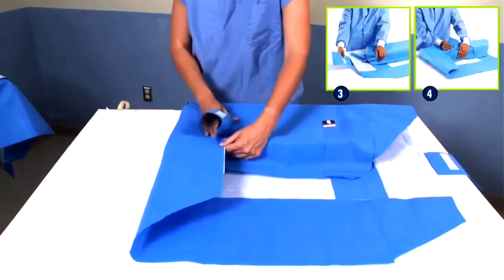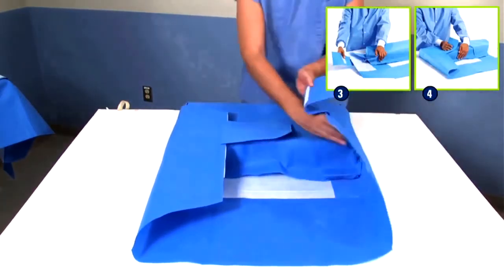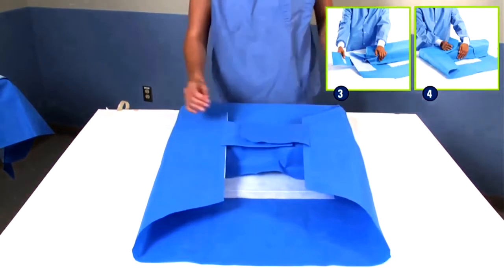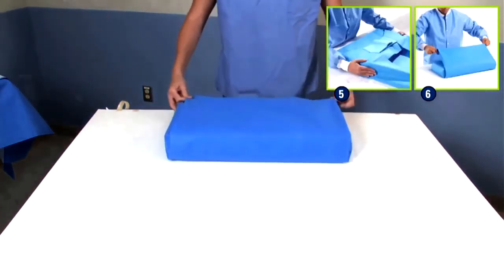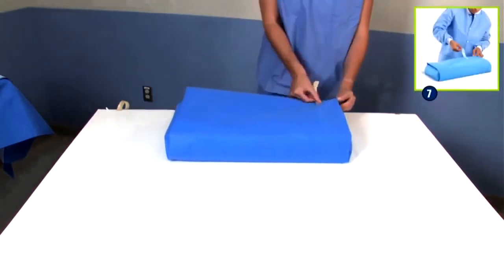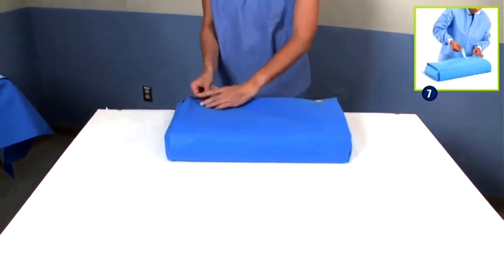Now we have materials to pack like this, which is reusable. You've got button-like things, you fold it, pack it. So you can have a separate pack for each case. So chances of contamination are very less. So you have a separate thing.